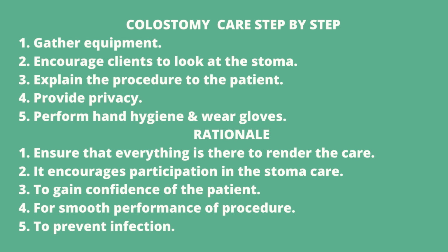Okay, second is encourage the client to look at the stoma. Encourage करना है client को, patient को, कि वो जो stoma है, वो जो opening है, वो उसको देखने के लिए. Fine. Explain the procedure to the patient. If there is a child, no need to explain because चाइल्ड कुछ समझ नहीं सकता बट उसके पेरेंट्स जो है वो समझ सकते हैं. So if the patient is not appropriate for that condition, for encouragement or for understanding, then at that time we need to explain all the procedures to the patient's relatives only.